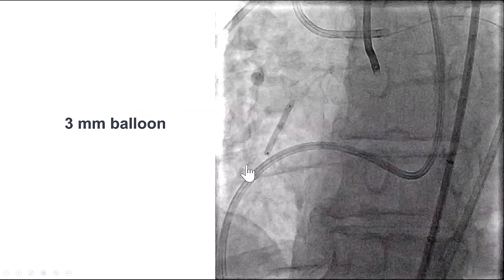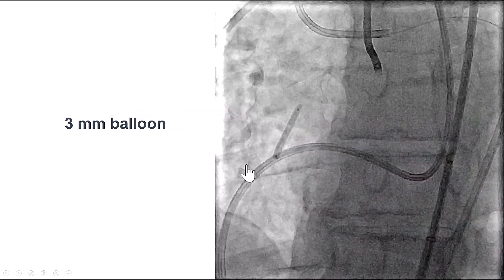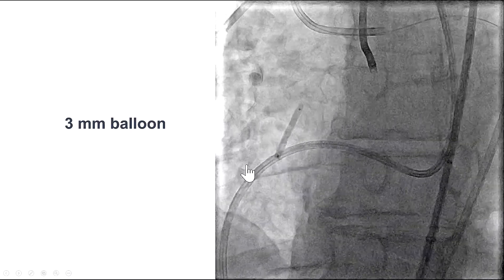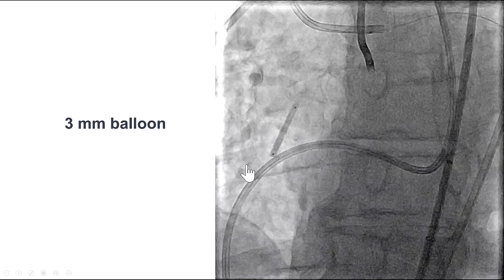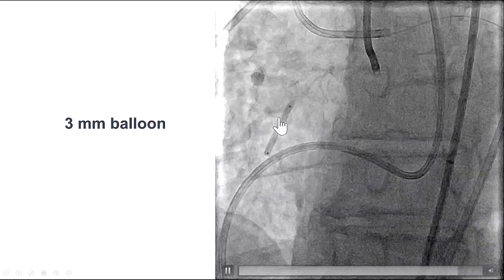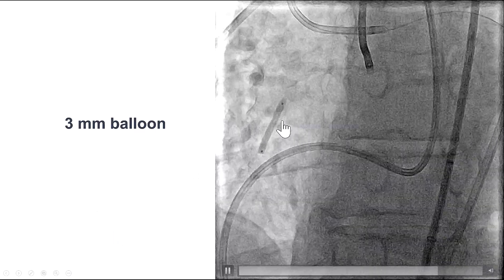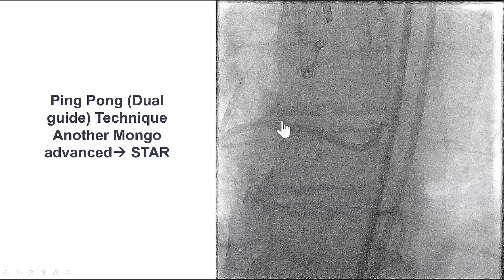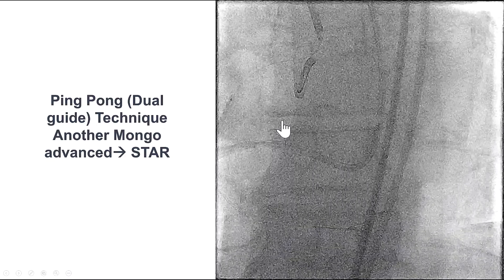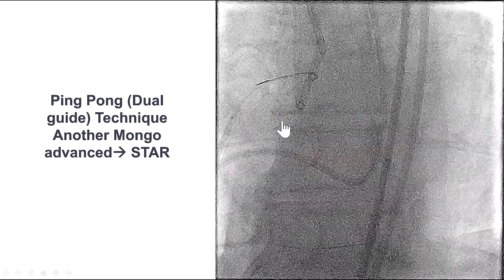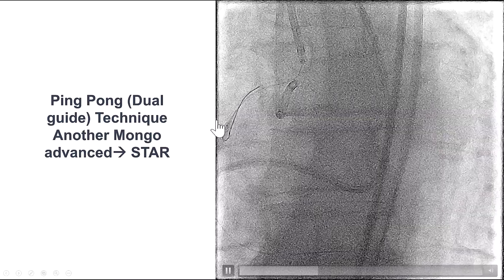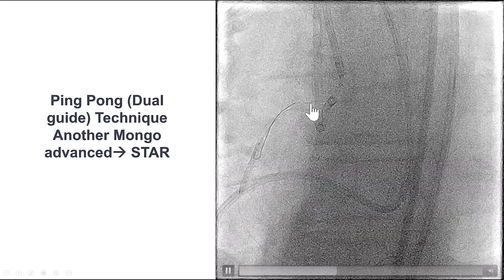We inflated a balloon. The next step in managing this essentially large vessel perforation — although it could involve a small vessel from the marginal — was to deploy a covered stent. We wanted to minimize the time that blood was flowing into the pericardium.